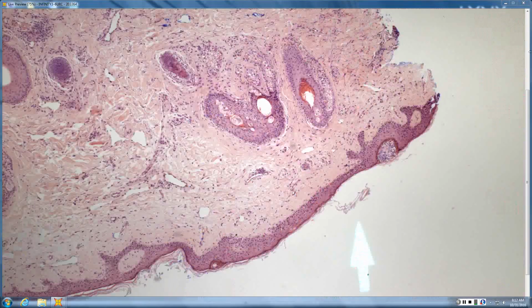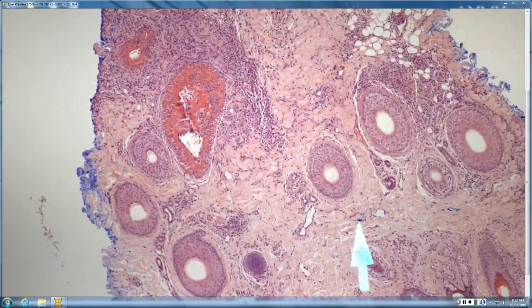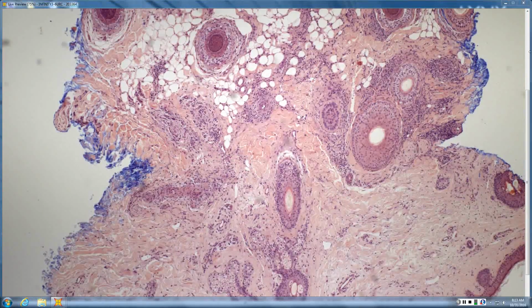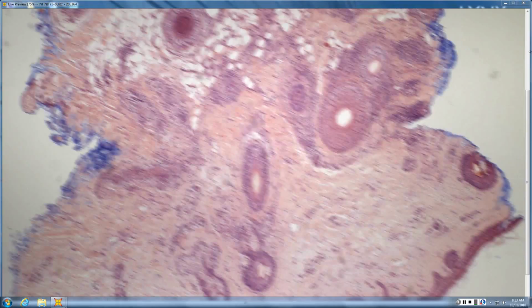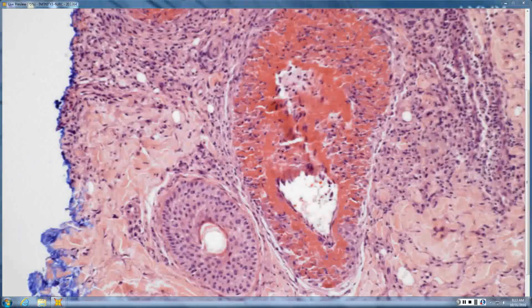Okay. So Kate, what do you see? So maybe it looks like facial skin or something like that. Yeah, could definitely be facial skin, and in fact, someone pretty hairy, so maybe more like scalp. Yes. Okay. So I believe in that section, you have a kind of a deep vessel with some transmural inflammation.